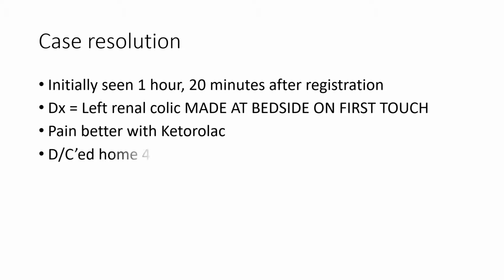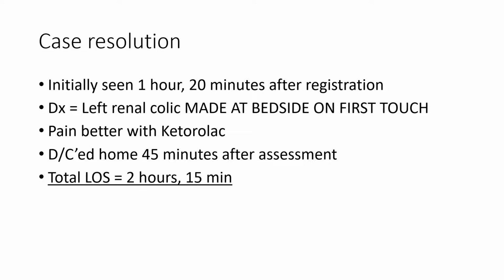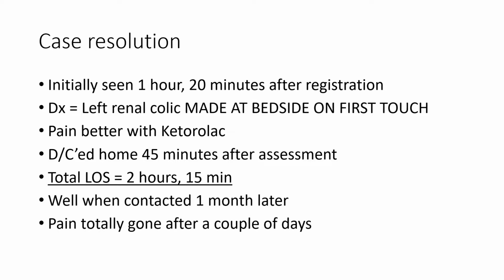At that point, they were discharged with a prescription for ketorolac and tamsulosin and PRN follow-up if they were not completely pain-free in a few days. The total length of stay was just above 2 hours. The patient did not return to the emergency department. Because I knew I was going to use this case in my presentation today, I contacted the patient 1 month later to confirm that his pain did indeed resolve completely after a couple of days.